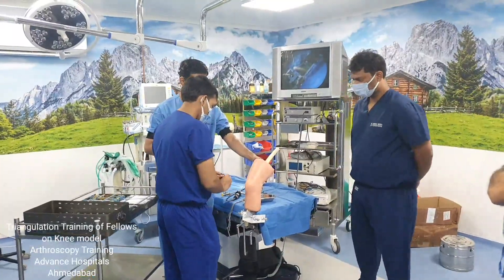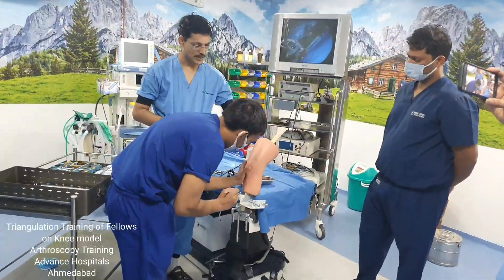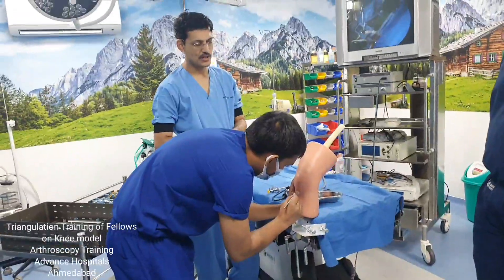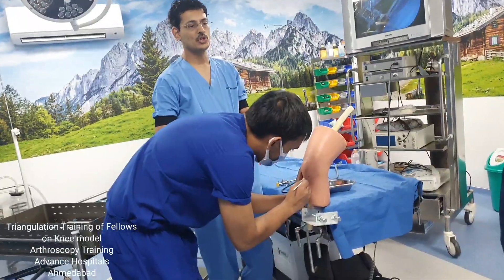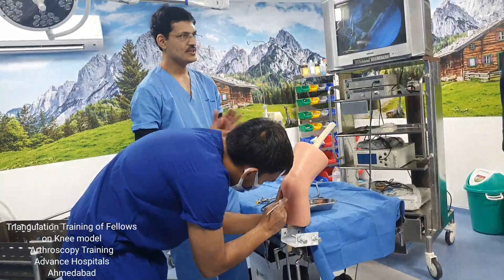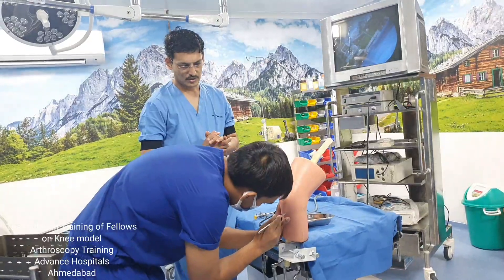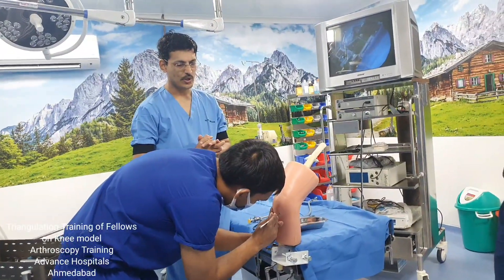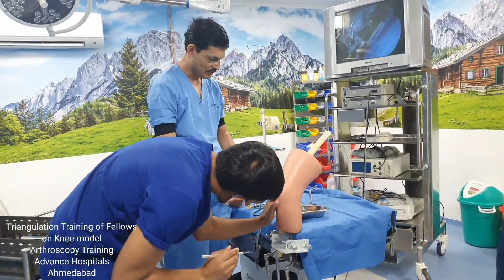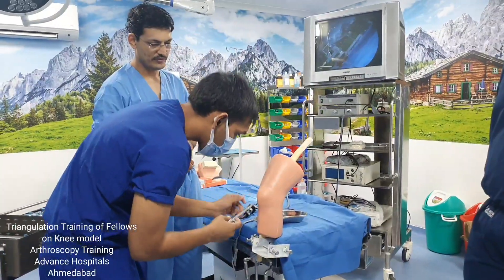This is an actual model of the knee, in which the knee is covered by a skin-like texture which gives the feeling of an actual knee. We are in the OT setup and have everything in place. We will be starting to actually demonstrate how we do an arthroscopy on this model. We have a scope in place — we make a portal and go in with the scope.